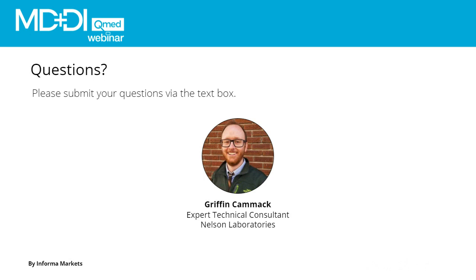Yeah, that is also an excellent question. I might say that after every question, I guess, but it is not a requirement per any standard. So there's no written requirement that says you have to do a disinfection as an interim process before sterilization. What we've seen is feedback from hospitals in Europe that have requested data on these interim processes.